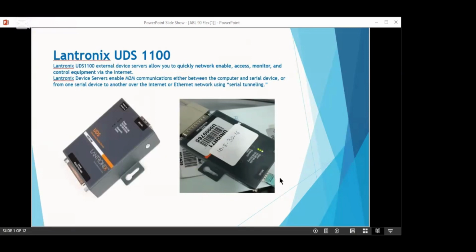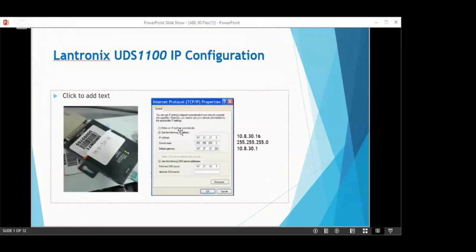You can connect through the RJ45 LAN connector with your computer or laptop. When you connect, there is an ID and password mentioned on the backside. You enter that and you will find the interface, same as this one inside. Inside you enter another IP for this device.